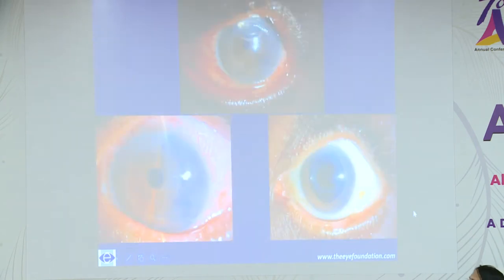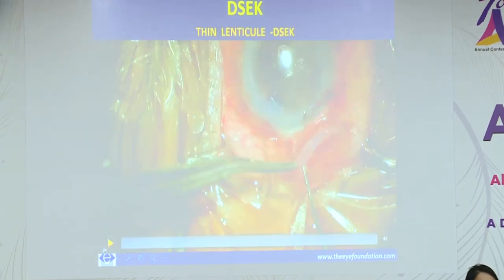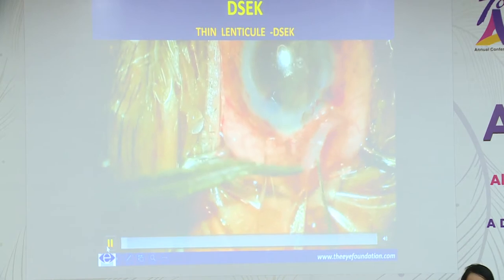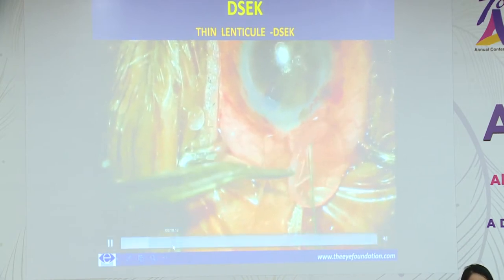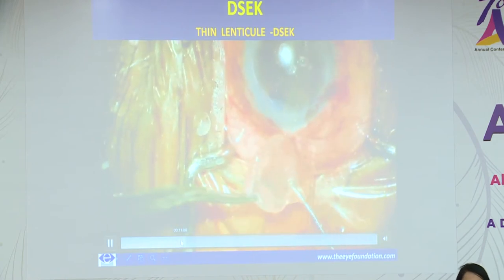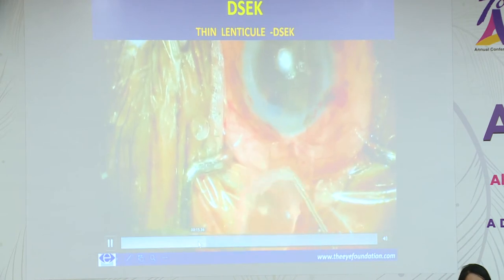This is the same patient, a post-operative picture on day 1, 2 weeks and 6 weeks. The OCT picture of the same patient. You can even go up to 400 microns, even 500 microns, and create a thin lenticule. Of course, handling of these thin lenticules may be a little difficult, but can be easily done.